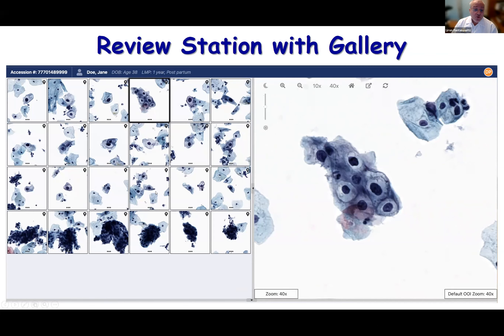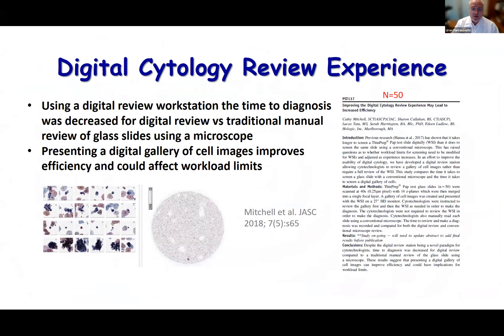For the most part, you only need these 24 images to render a diagnosis; if you're not happy, you can click to get more images delivered. This allows you to still incorporate the cytotechnologist in your workflow — a cytotec reviewing the case first would click on the thumbnails they think are important, and those images drop to the bottom. When the pathologist logs in, they see the same gallery and whole-slide view, plus the images the cytotec annotated at the bottom. That's how the system is designed to integrate cytotec and pathologist workflows.